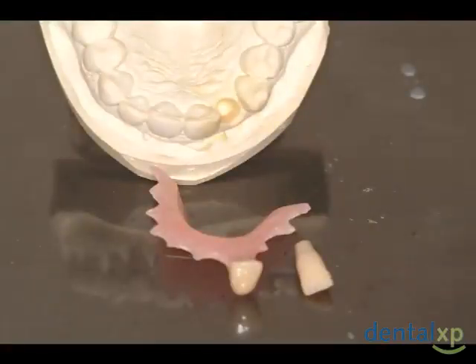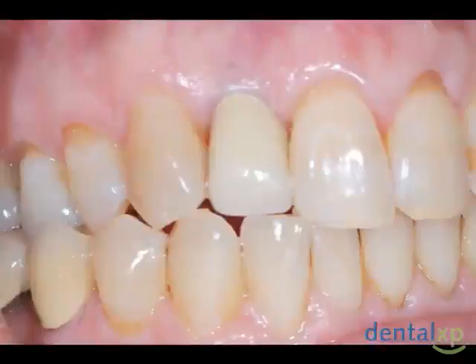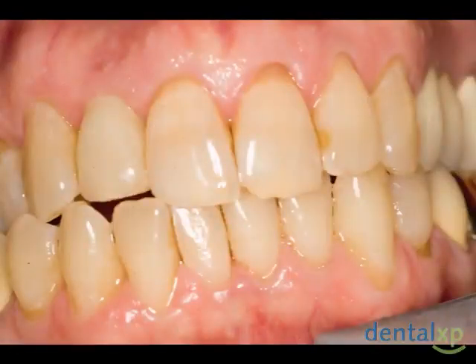In this case, 2 provisionals have been used. One removable during the time of healing, the second to create the proper emergence profile. And the final restoration showing the emergence profile that has been developed by a provisional restoration. And the final view of the anterior region of the mouth.